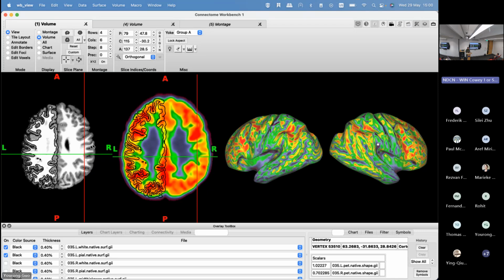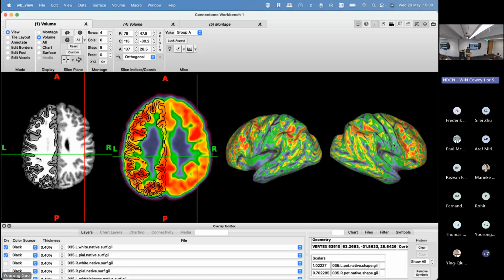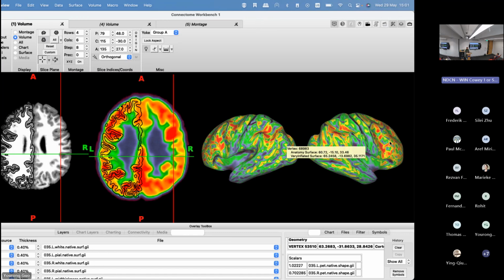It's very difficult for you to visualize it or to find it in the volume space, but on the surface it is quite easy because you only have one view. At the same time, it's also worth noting that you can't hide any of your results on the surface, and you can't just choose the best slices you want to show in your result, because you see everything here on the surface, so you can't fool everyone.